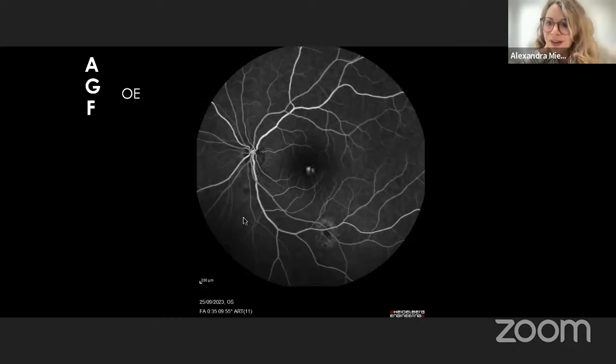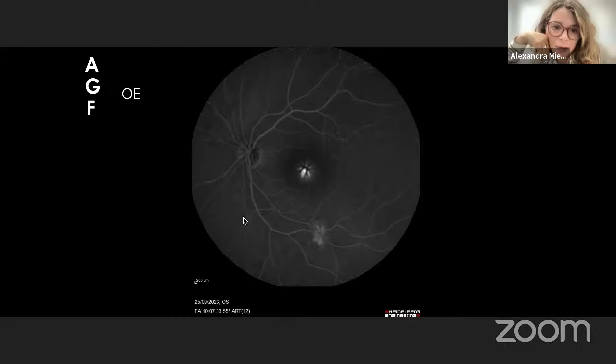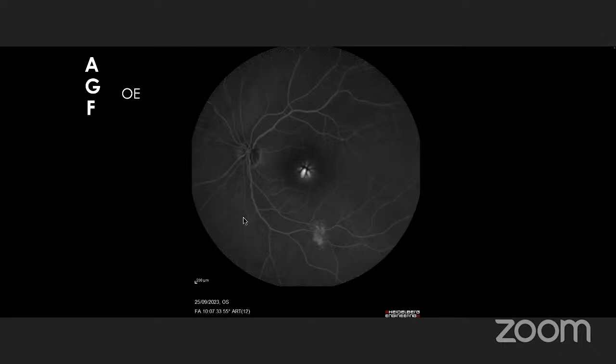So, did you categorize it? Was it a woman or a male? Woman. So, this is 52. Another argument in favor of inflammatory etiology, but there are no other lesions that might suggest it, besides the lesion on the inferior arcade, that might be related to anterior inflammation. There were not any lesions. Only this one.